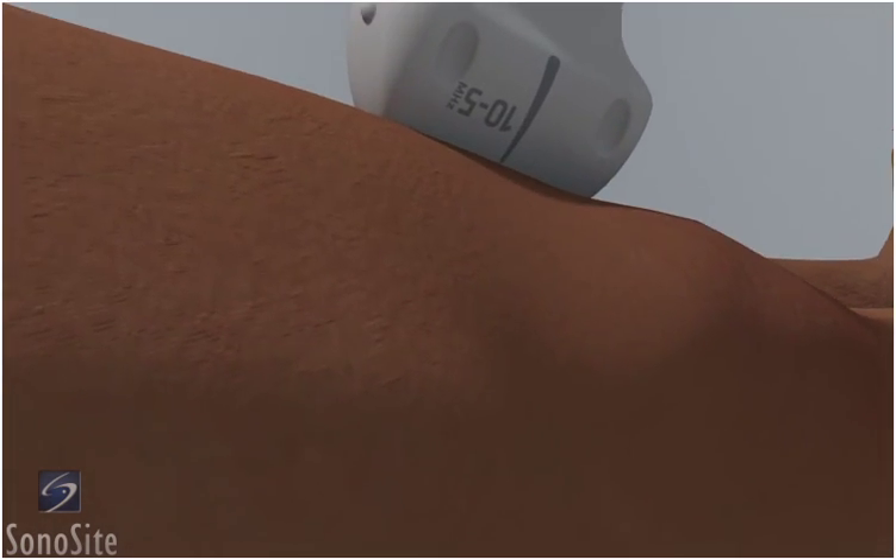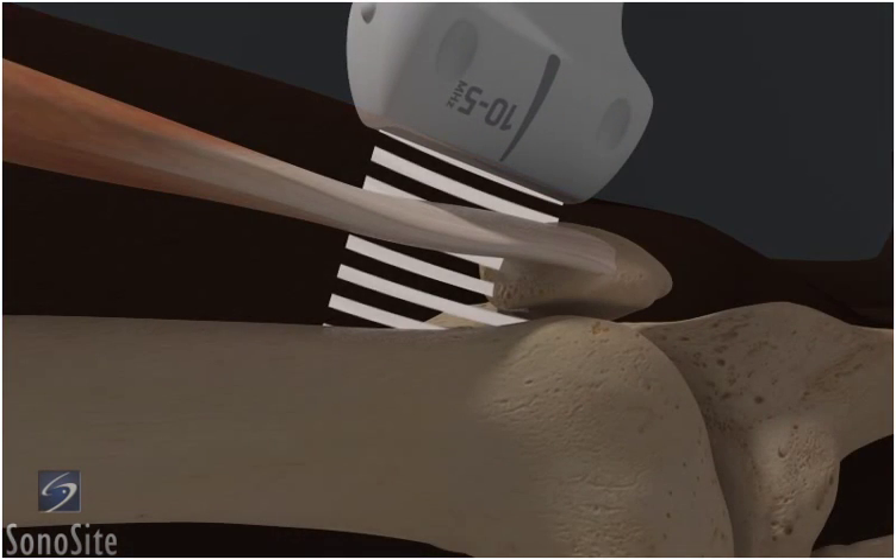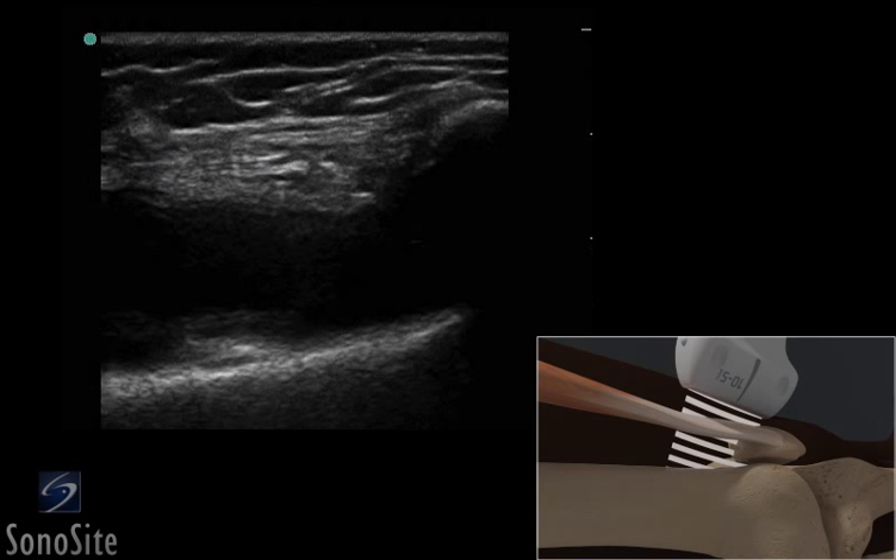The transducer is placed just proximal to the patella in a long axis fashion. The fibrillar pattern of the patellar tendon is seen above the rounded, bright, hyperechoic surface of the distal femur and patella.